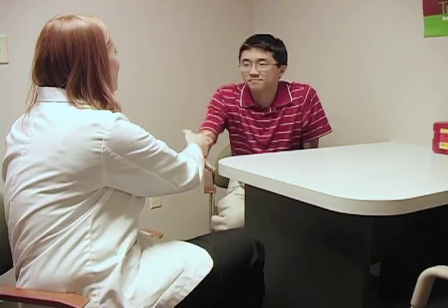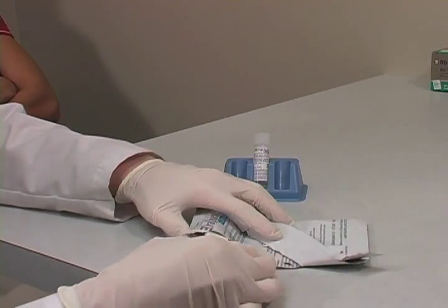The first step is the specimen collection. Ensure that prior to testing, the subject has not had anything to eat or drink or chewed gum for at least 15 minutes. Have the subject wait for at least 30 minutes prior to testing if they have used any oral care products. Remove the device from its pouch.